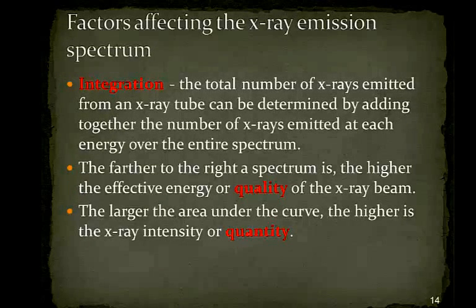So, the different factors that are going to affect the X-ray spectrum itself. The first thing is integration. It's the total number of X-rays emitted from an X-ray tube. So you add together the number of X-rays emitted at each energy over the entire spectrum.